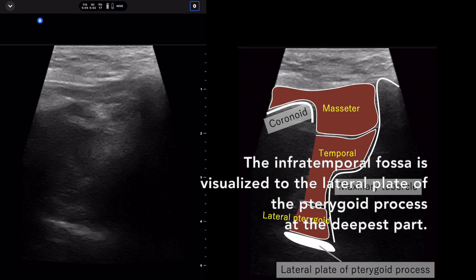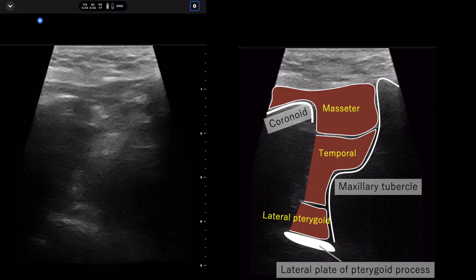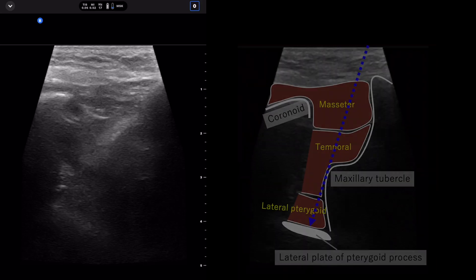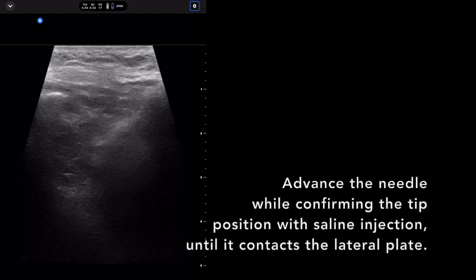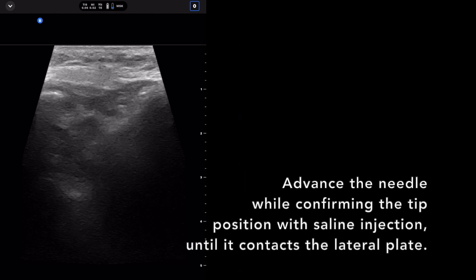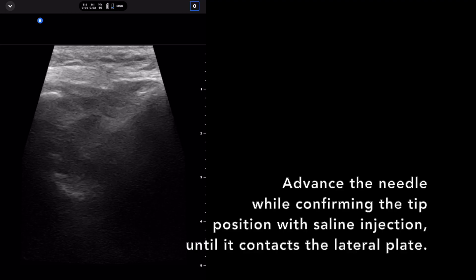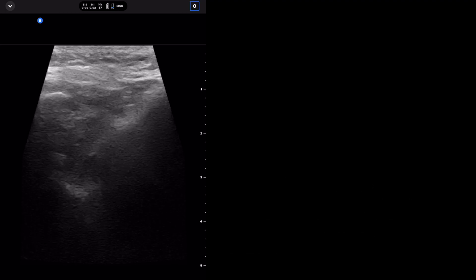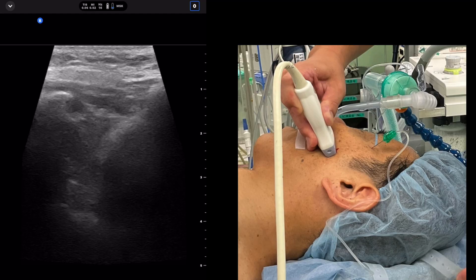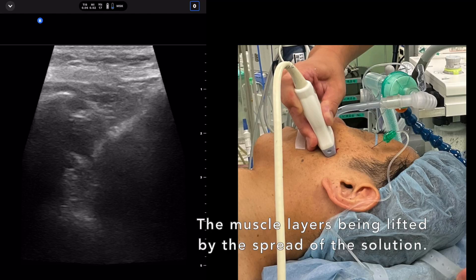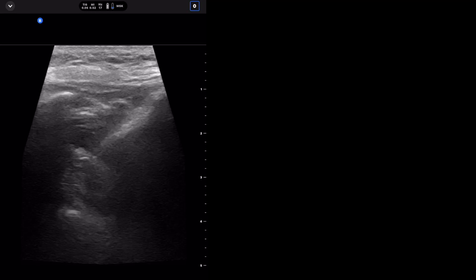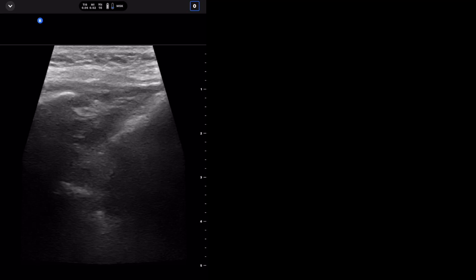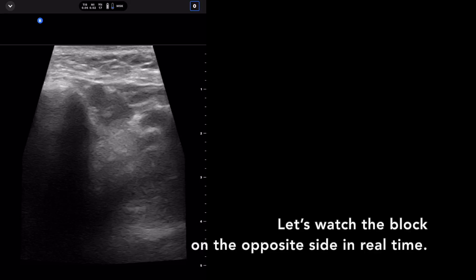The infratemporal fossa is clearly visualized all the way to the lateral plate of the pterygoid process at the deepest part. Needle insertion has begun, but the needle path is not visible at all. Advance the needle while confirming the tip position with saline injection until it contacts the lateral pterygoid plate. Local anesthetic is injected — you can see the muscle layers being lifted by the spread of the solution.